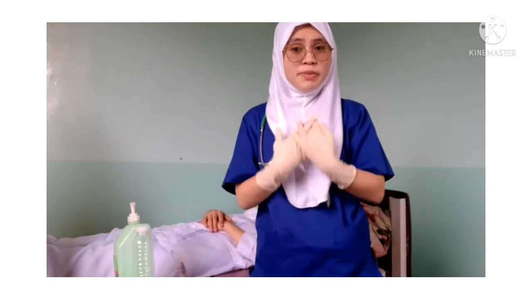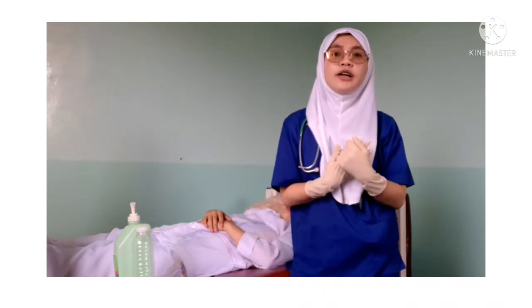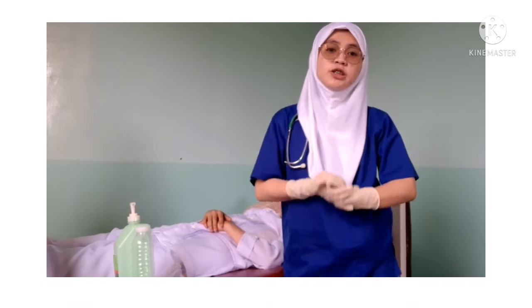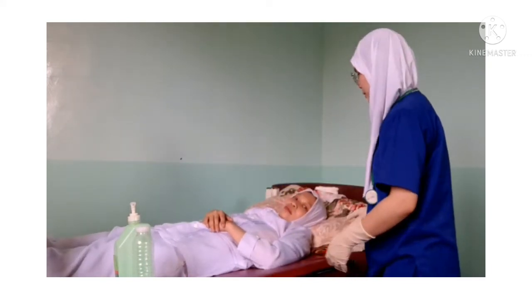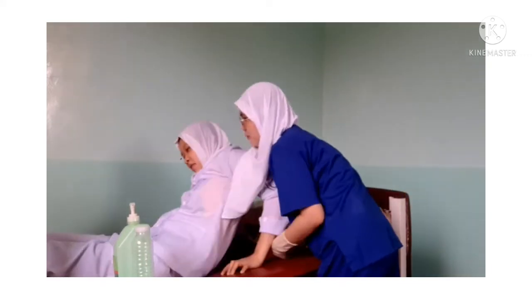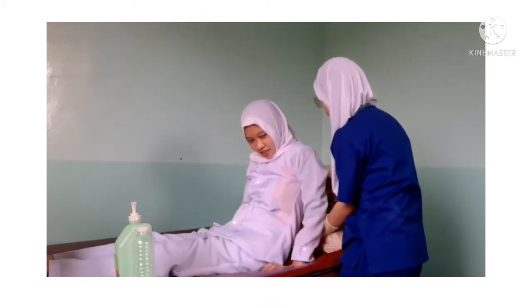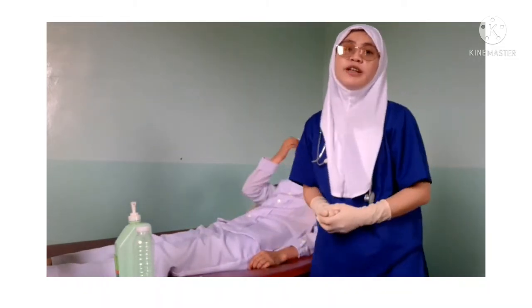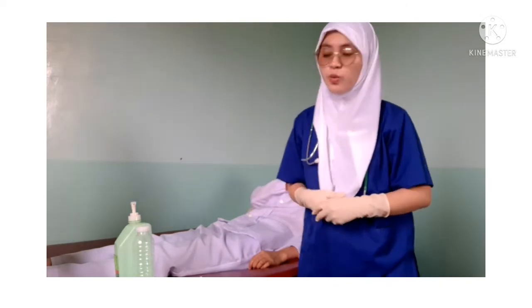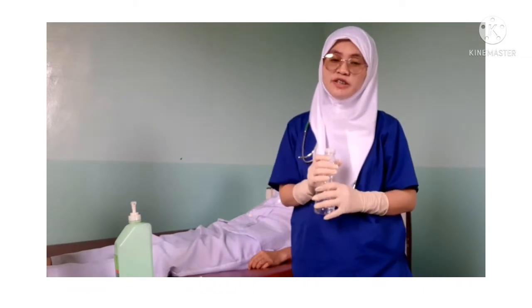So, place the patient in semi-Fowler's position. It allows maximum chest expansion in clients who are confined to bed, particularly those with dyspnea. And now, let the patient rinse her mouth with water to avoid contaminating the sample with food residue.